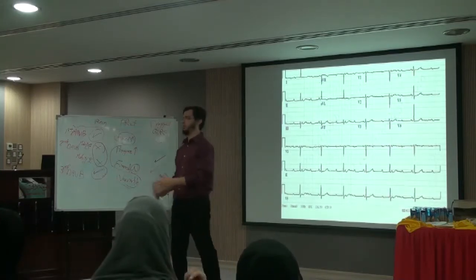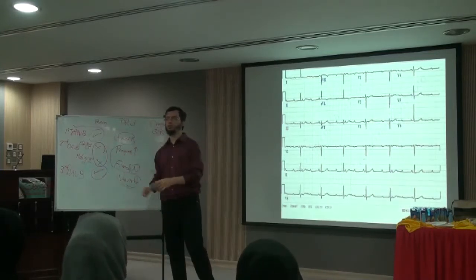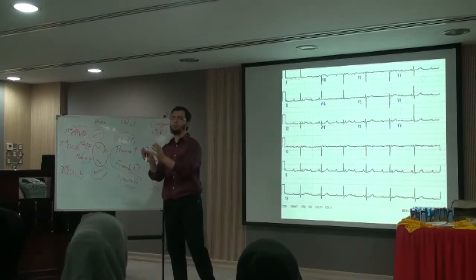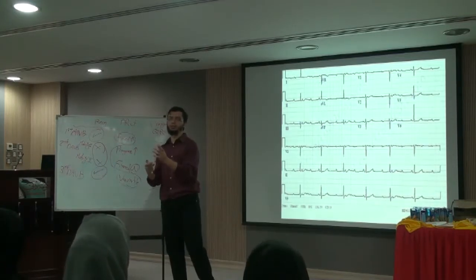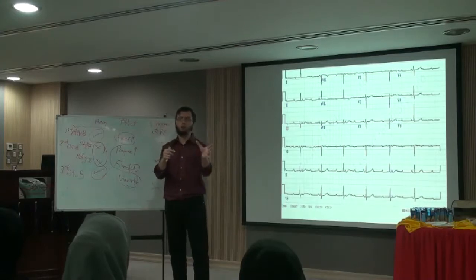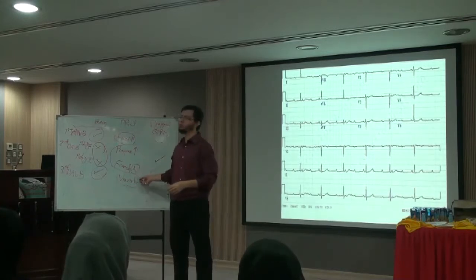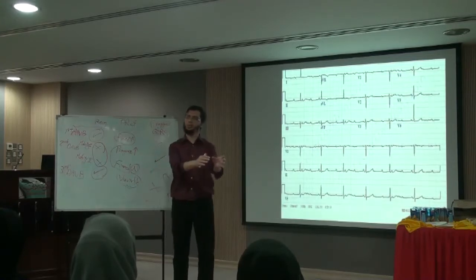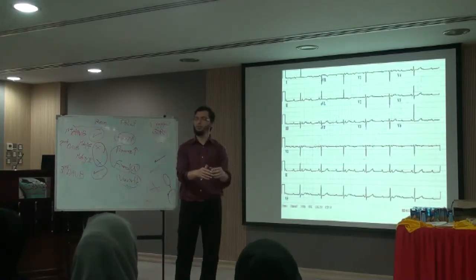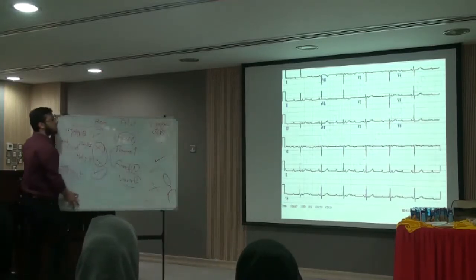Alright, this is the complex way. Now the easy way. First degree, PR interval, fixed prolonged. Only fixed prolonged. Mobitz type 1, PR interval progressively prolonging. It's more serious, but it's telling you, I will block, caution, take care, I will block, and then it gets blocked. Mobitz type 2, it's worse. It tells you, I'm fine, don't worry, trust me, and then it collapses. So, do you trust it? No. So it's worse. Mobitz type 2. Then third degree is the worst. No relation at all.